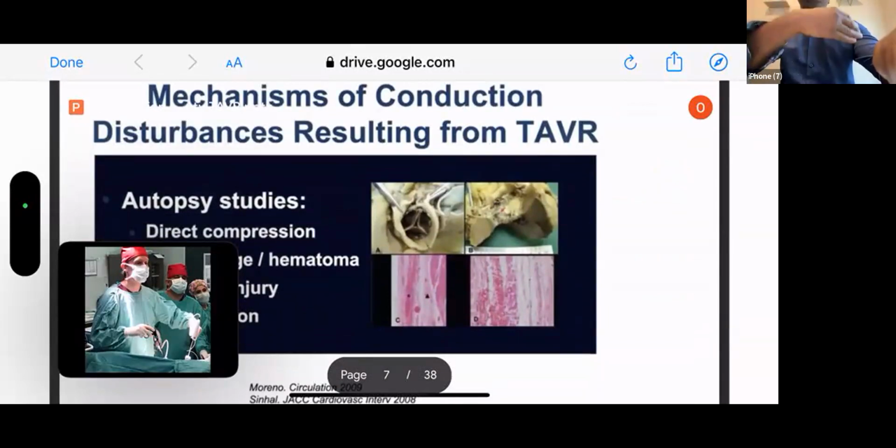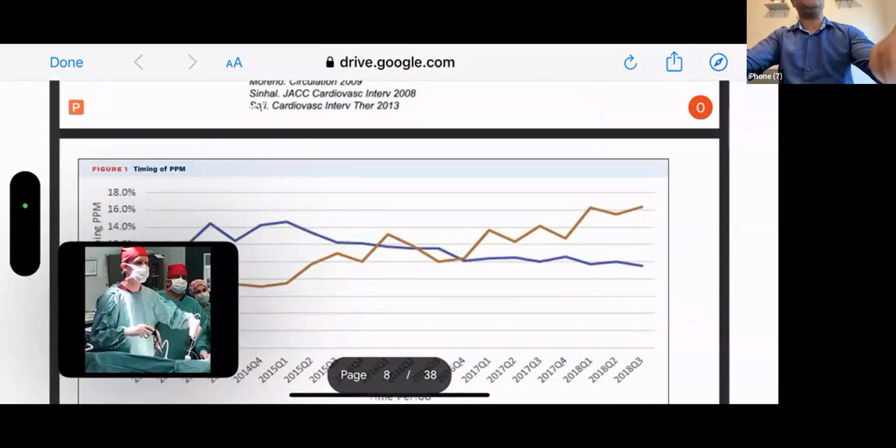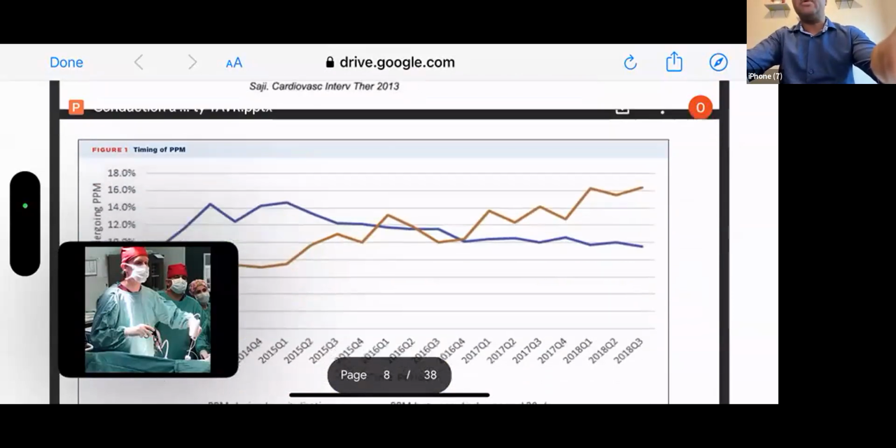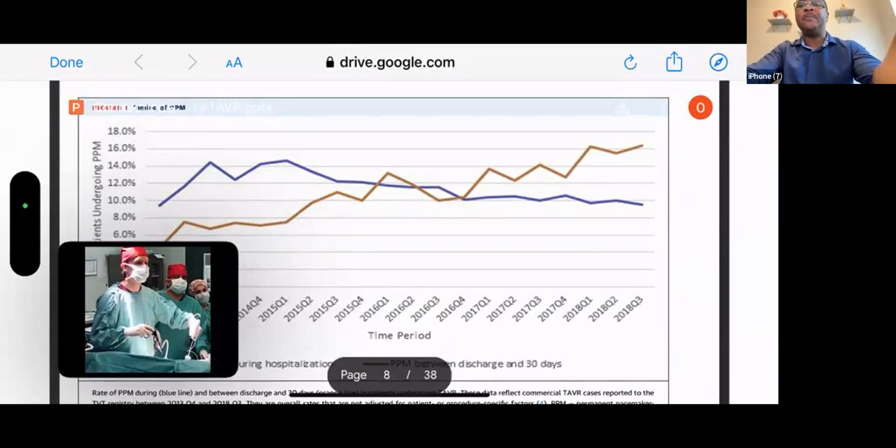But we noticed that over some days the hemorrhage and inflammation may improve over time. And if they do improve, then sometimes the conduction abnormality that we have, such as left bundle branch block, may also improve. So that is why sometimes we don't rush to put in a permanent pacemaker. We usually put in a temporary pacemaker, which I'm going to talk about.